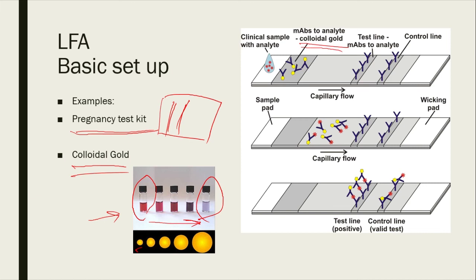So those are the two basic components in the lateral flow assays. Now there are different structural or material components, different pads. I won't dive into it, those are too much for you, I think. So the idea is having a strip, where first you have a place to collect your clinical samples with analytes. With or without, if it is a control, there would be nothing, right? With a clean sample, there will be no analyte. If it is a relevant sample, you have analyte there.